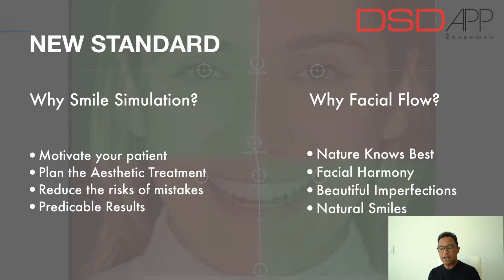And why do smile simulation? We believe that doing smile simulation, you can motivate your patient. You can plan aesthetic treatment. You can reduce the risks of mistakes. So let's say you now know exactly what your patient wants from you, and you can also deliver predictable results.